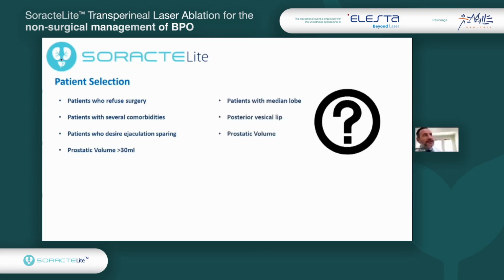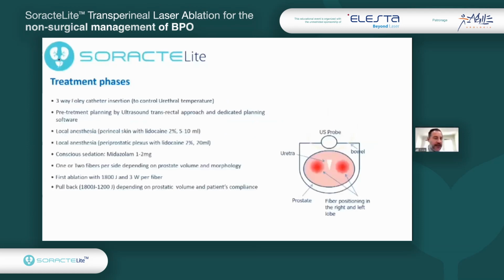And we are still investigating, in my experience, if and how we can treat patients with a median lobe, or patients with a very large or hypertrophic posterior vesical lip. And also we are investigating which is the best prostatic volume to obtain the best results with the technique.